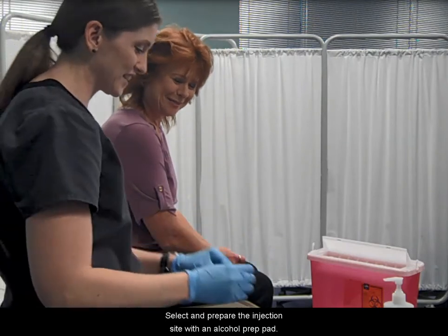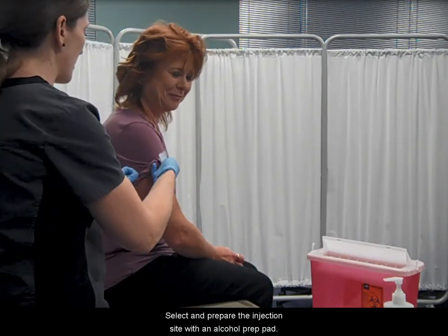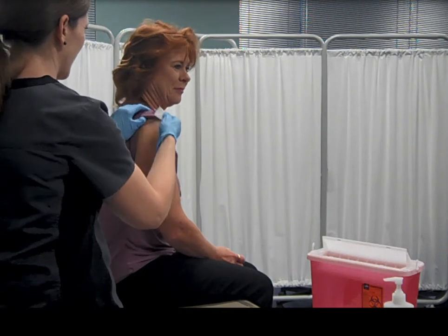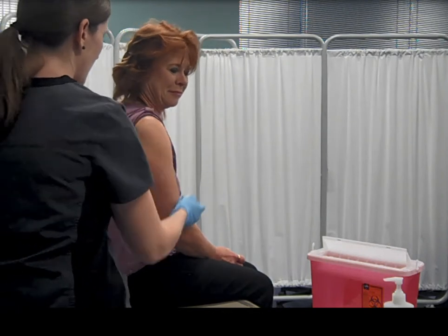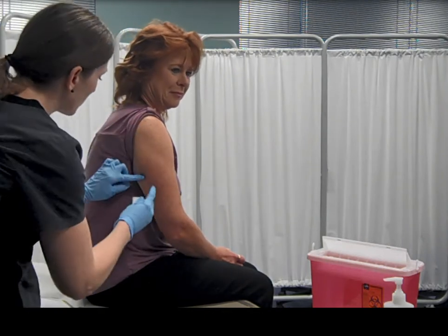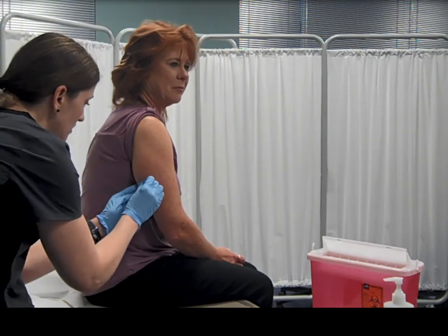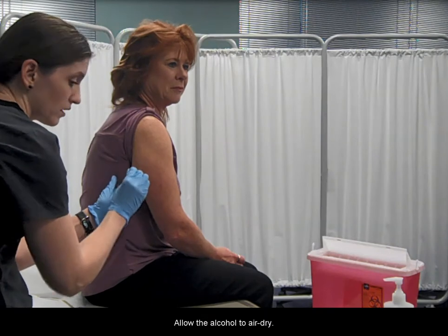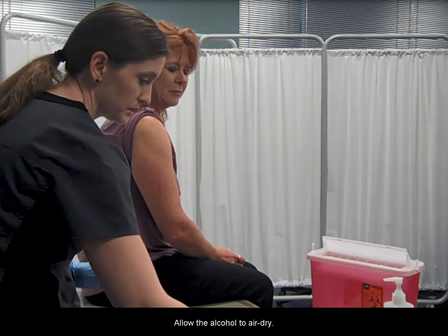Select and prepare the injection site with an alcohol prep pad. Allow the alcohol to air dry.